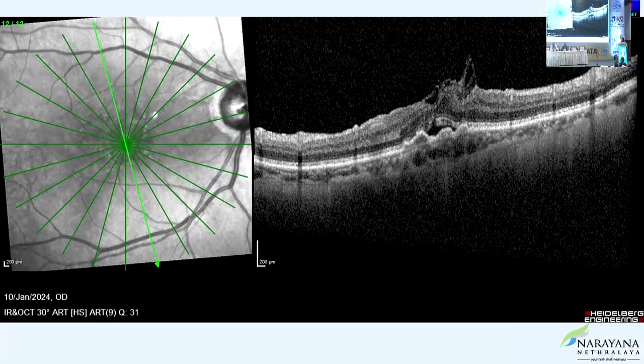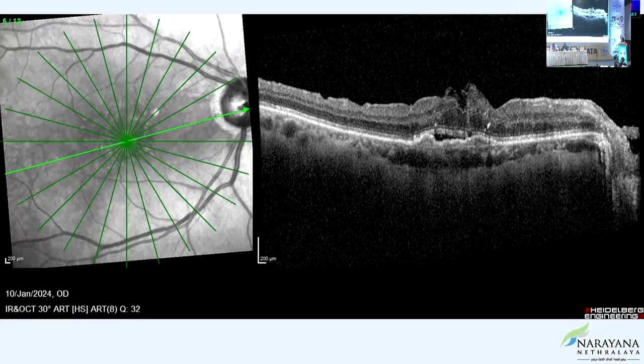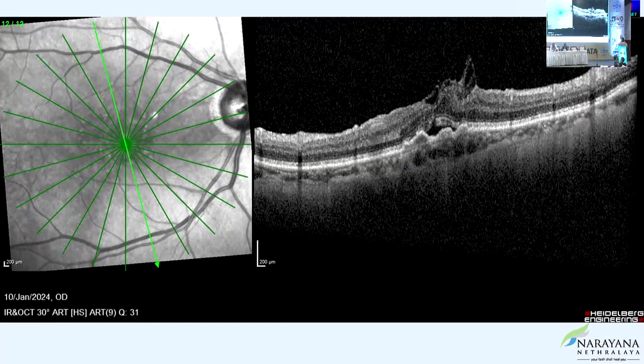So would the macular hole open? Do you think there's a risk here? Because if you see in this, there's a slight splitting there. Correct. But then you relieve the tangential traction, so the chance of it opening, yes, it can open, and then probably anti-VEGF and anti-inflammatory agents may make it close again. So that's probably for your next Retinnova, I think. I hope. You've not operated on this, have you? I have, sir. Oh, you did? Yeah. Okay. That's how it's closed. She came back to 6/9, but then the CNVM recurred.